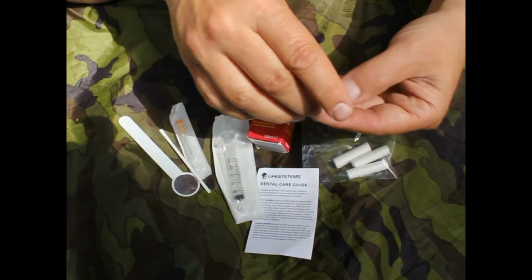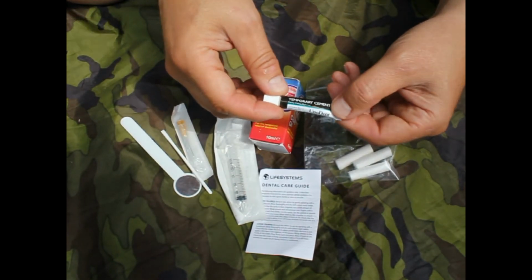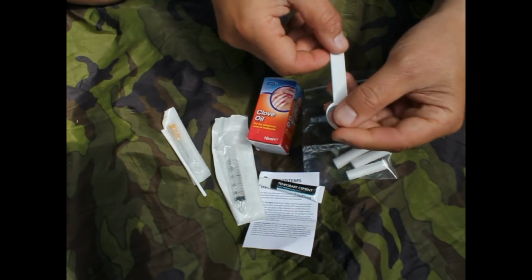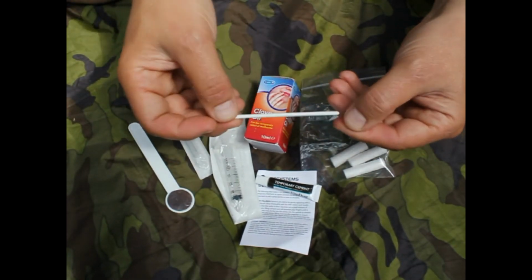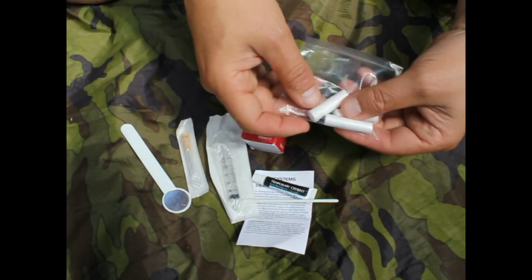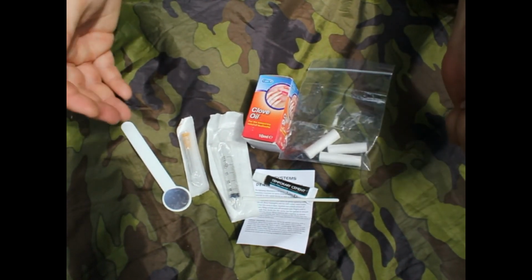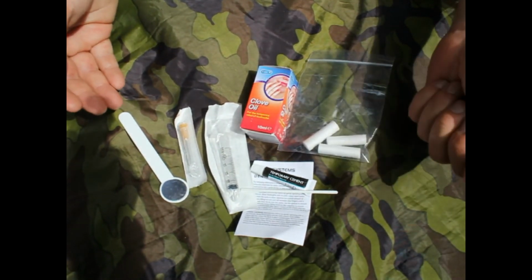You have some temporary cement here that you can put in holes in your tooth. You have a small plastic mirror here, so you can take a better look at what's inside. You have this spatula, what you call it, for the cement. You have a needle and a syringe, and you have these cotton pieces for your mouth.